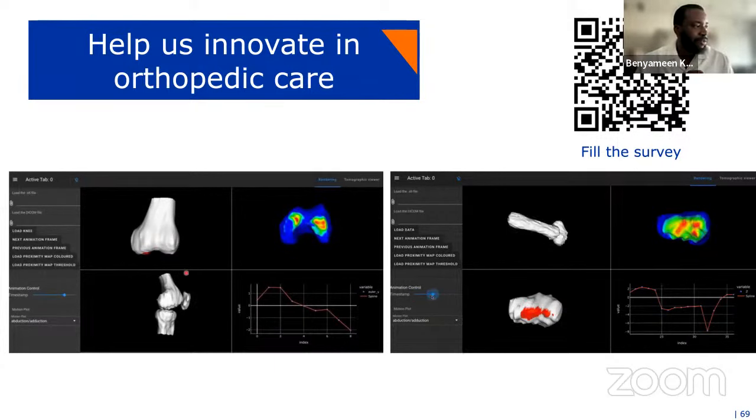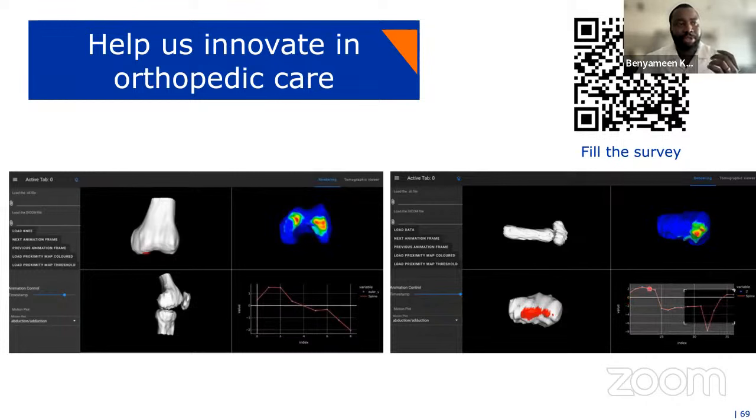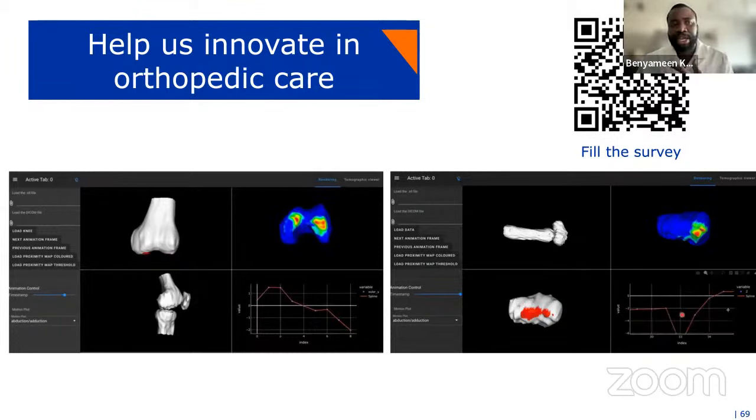There's an example we have on the knee, and there's that case of the thumb where you actually see these proximity maps as I described. But you can also look at the motion, for instance, of one bone relative to the other. You can choose which bone you're interested in, and the idea is that we're able to provide this and make an impact in how some of these conditions are either diagnosed or treated, or how they are followed up.